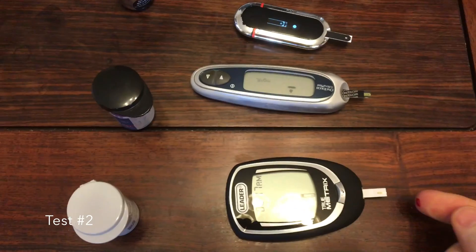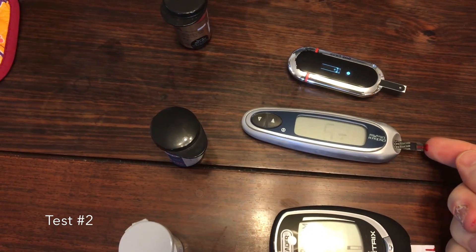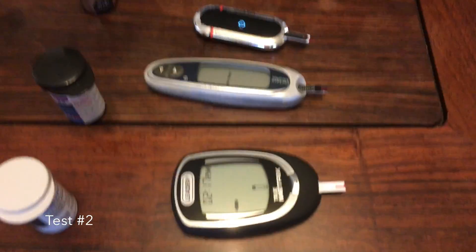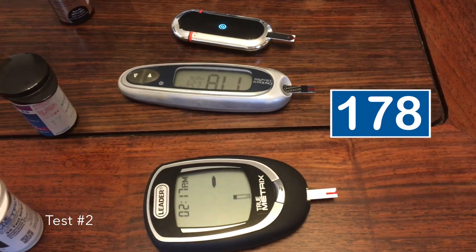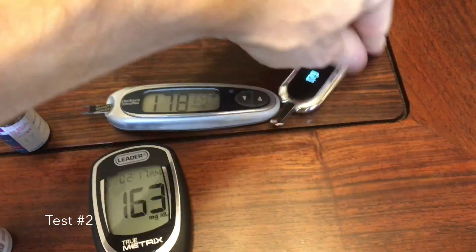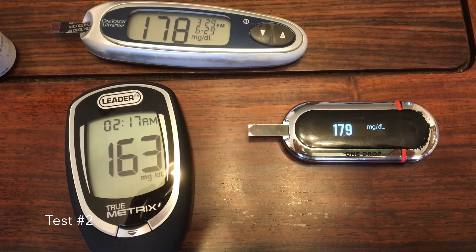Test number two on a different day. OneTouch: 178. TrueMetrics: 163. OneDrop: 179. Same basic result — TrueMetrics about 15 points lower than the Ones.